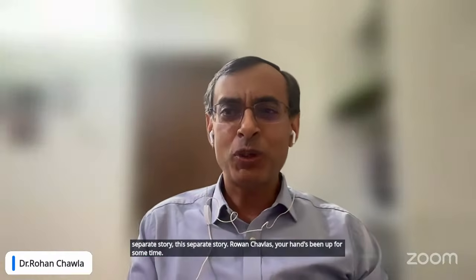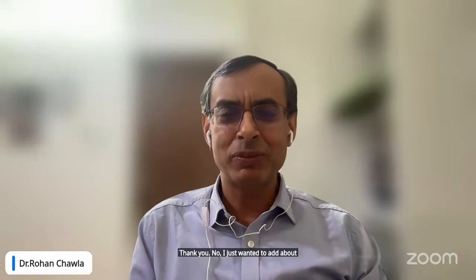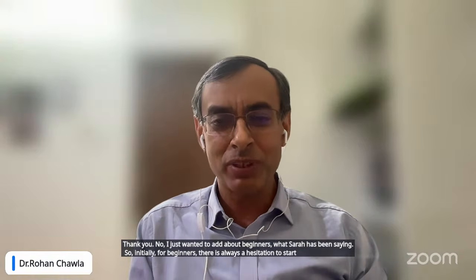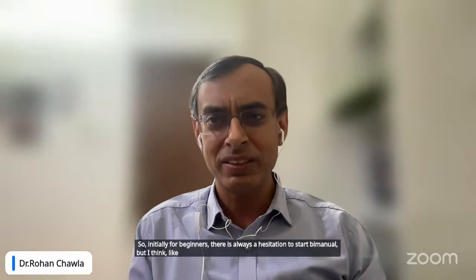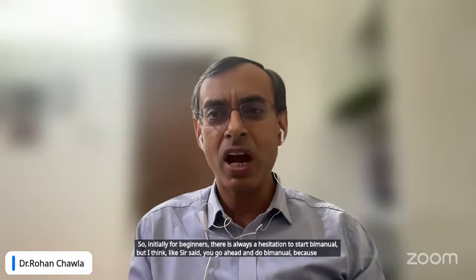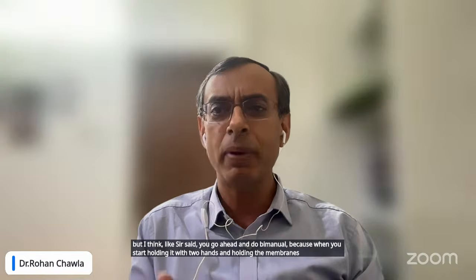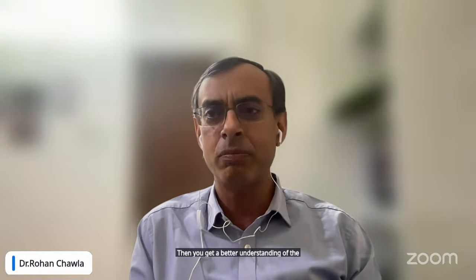Thank you. No, I just wanted to add about beginners, what sir has been saying. So initially for beginners, there is always a hesitation to start bimanual. But I think like sir said, you go ahead and do bimanual, because when you start holding it with two hands and holding the membranes, then you get a better understanding of the planes and the second membrane.